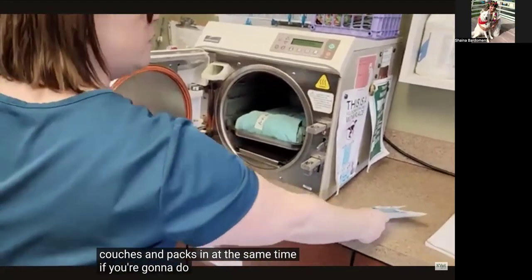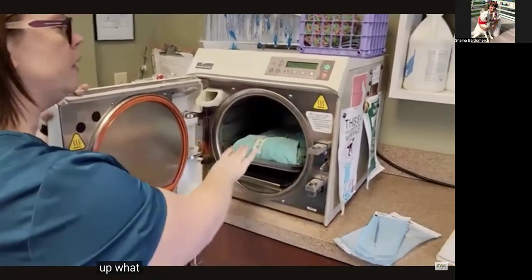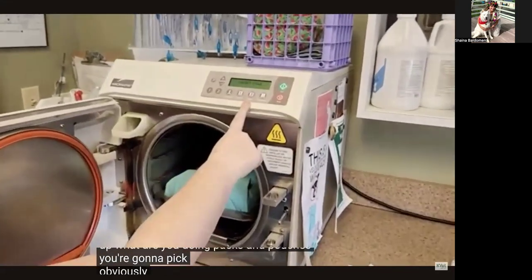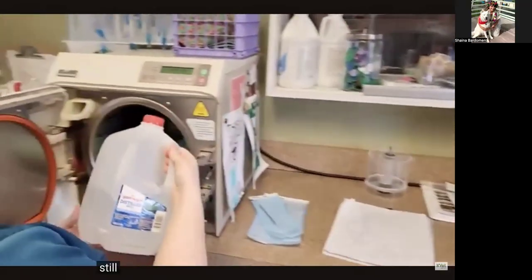If you're going to do that, though, you need to make sure and do the setting for the pouch. So if you're doing packs and pouches, you're going to pick the packs setting. Obviously, if it's just pouches, then you can just do the pouch setting. Distilled water.